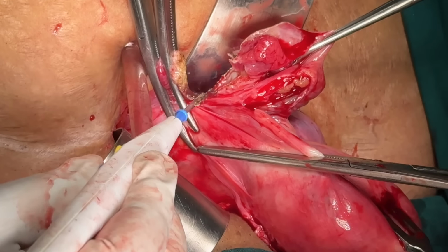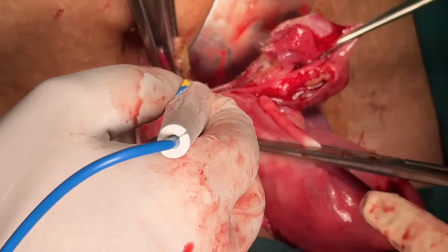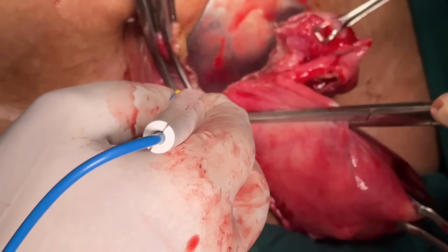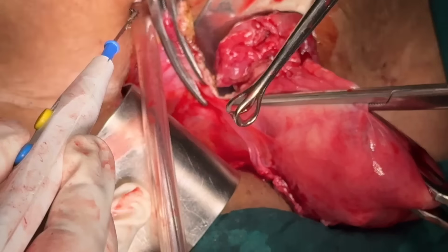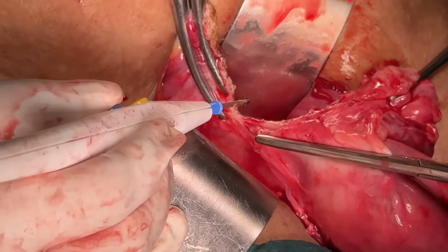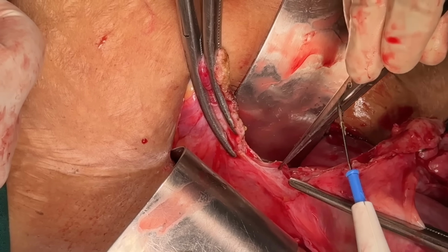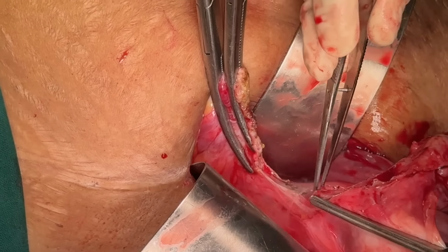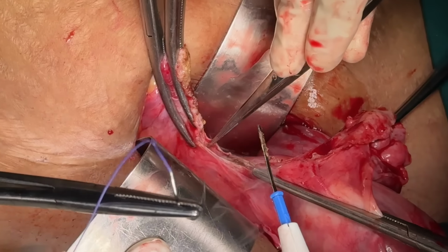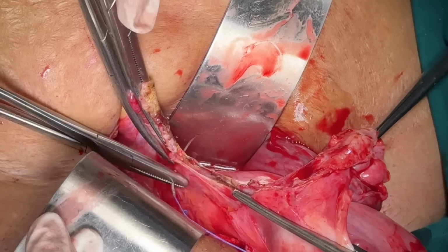as it has important structures in it, and after clamping it is cut with the help of a cautery in an L-shaped fashion. If there are bleeders, usually they happen in the peritoneum because of a non-well-fitting clamp. It's better to coagulate them to control bleeding. After clamping and cutting, the third step is transfixation.